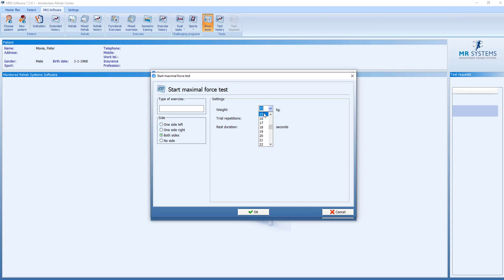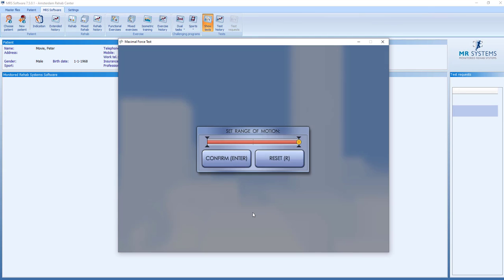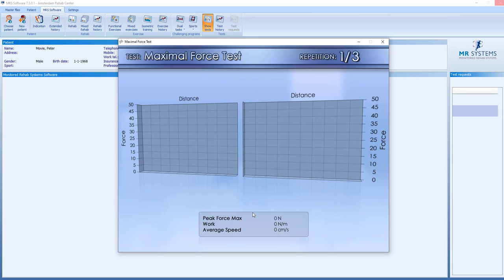We can select the weight where we start our trial repetitions and the rest after we have done the trial repetitions. We first will do one repetition to set the range of motion for this Maximal Force Test.